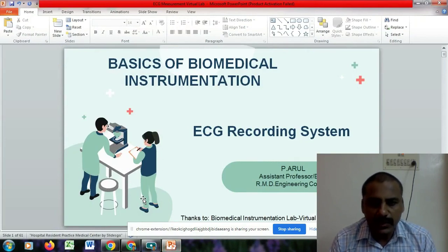So already I posted that ECG recording system part 1 video. In that video, we already discussed the theory and principles of ECG waves and ECG signals, and how the electrodes are placed using the three-lead Einthoven triangle system.